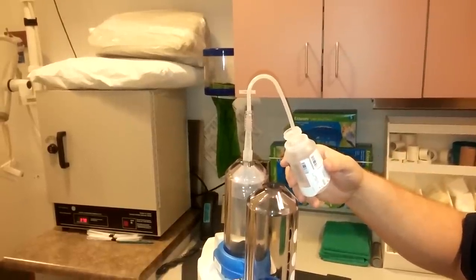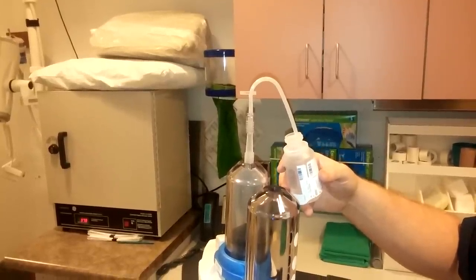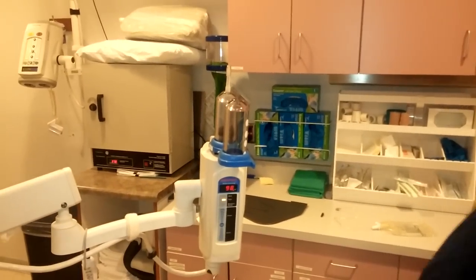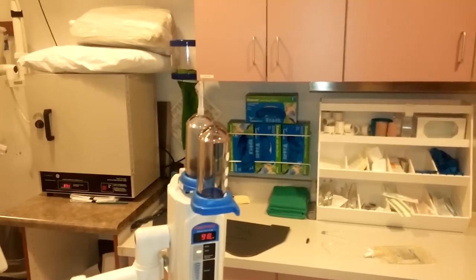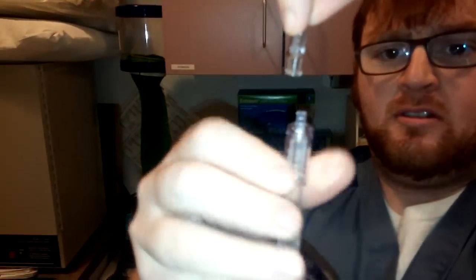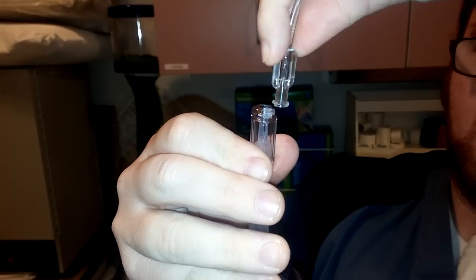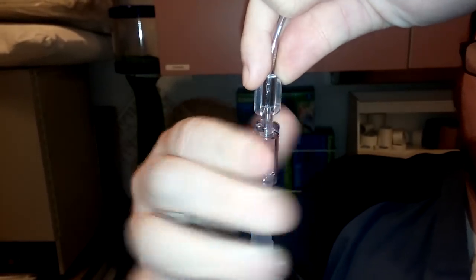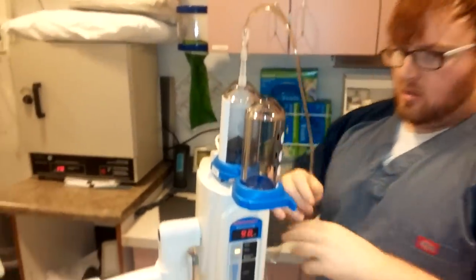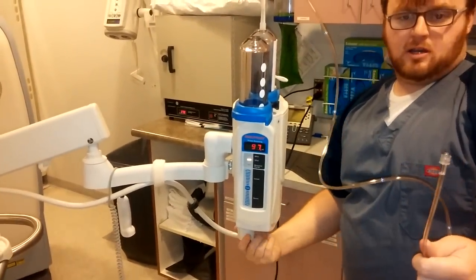Now we'll flush the air out. Then we'll put the tubing out like so, and purge all the air out by twisting on the bottom here.